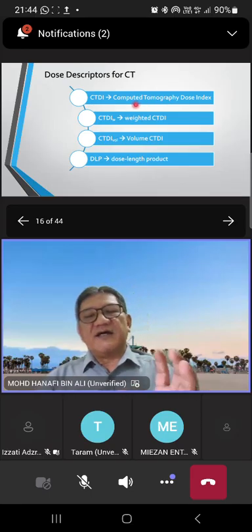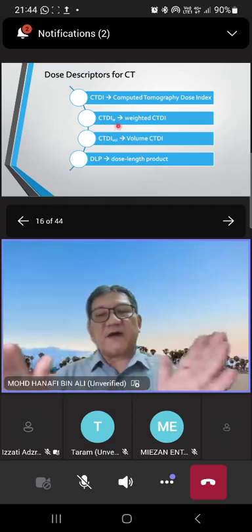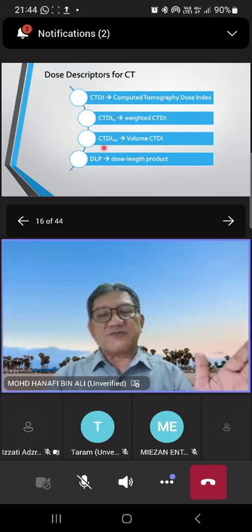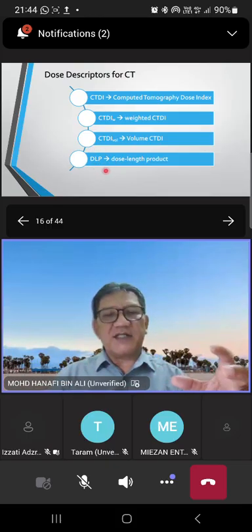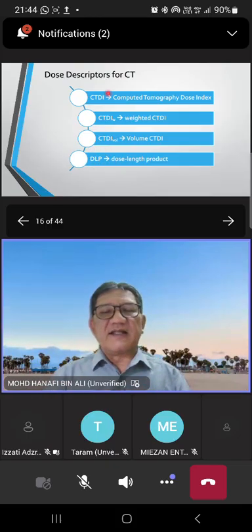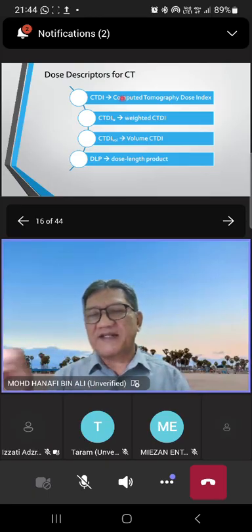When we want to measure the patient dose, we take note of how far the scan goes. That is what we call the dose length product. After that, we calculate. We multiply these two measurements, then we get the full amount of radiation dose to the patient. But it is still not complete yet.